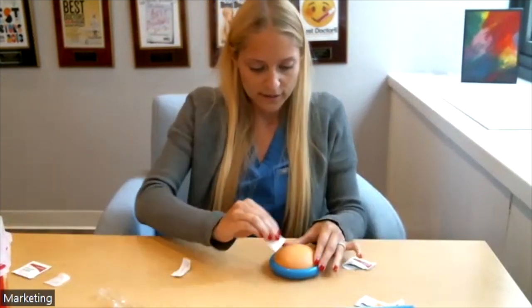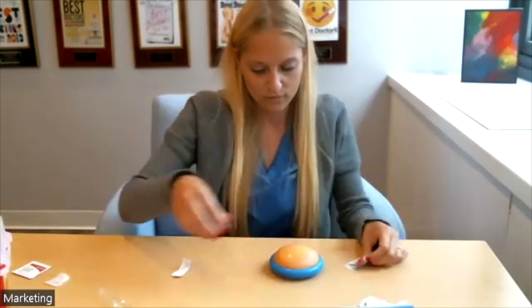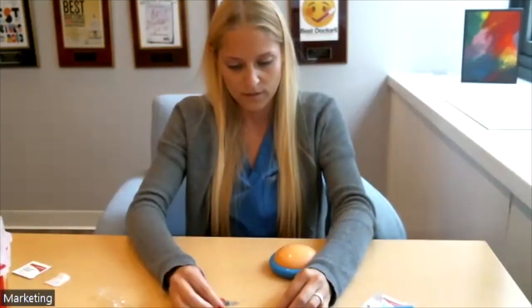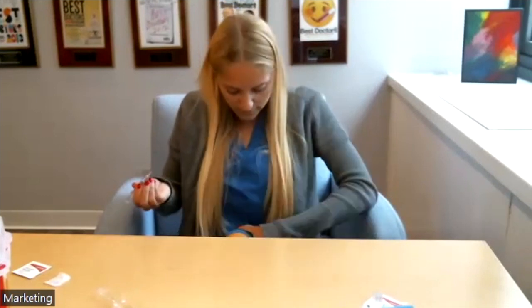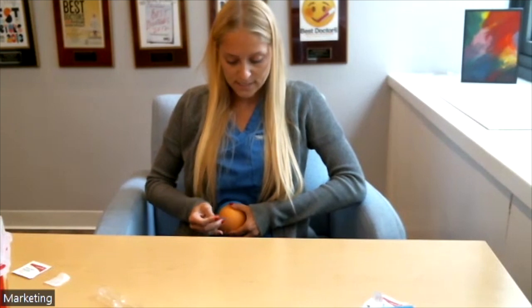Same thing — clean your target skin. You may want to do it on opposite sides, just in case you have a reaction to the medications, so you know which one was injected where. Pinch your target skin, inject it straight in, push the plunger down, and release. Toss the entire thing in the sharps container. Once the medication is administered, wait three to five seconds to make sure no lingering medication is sitting in the syringe.